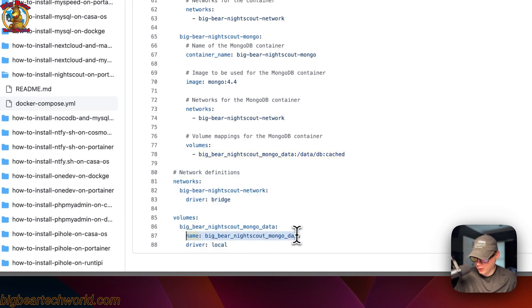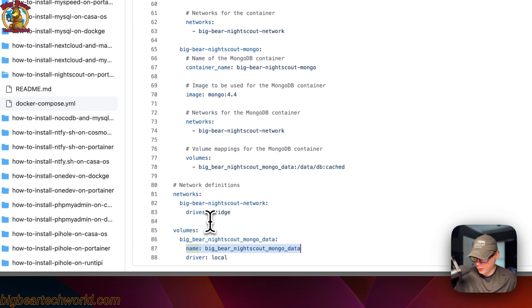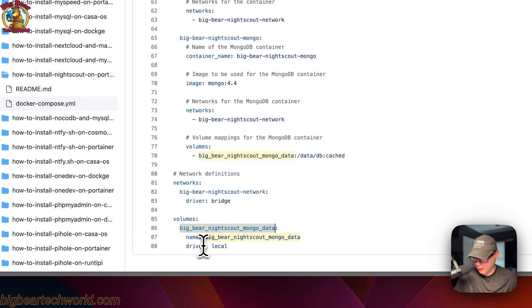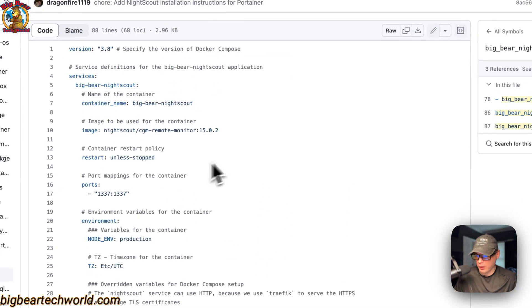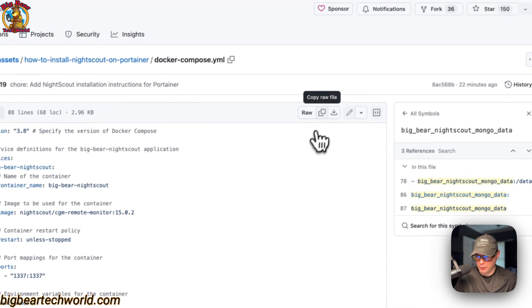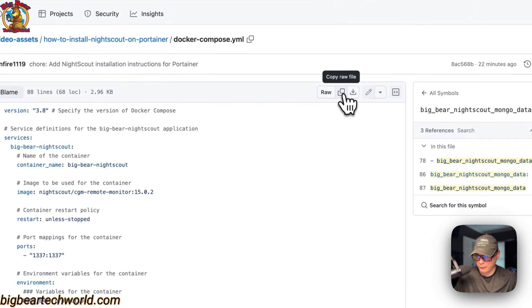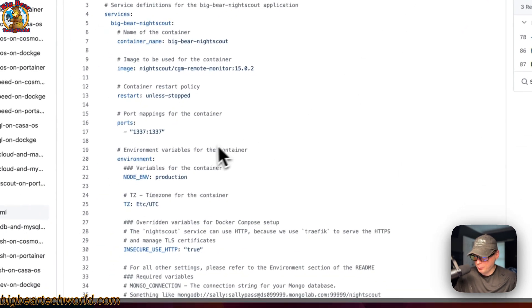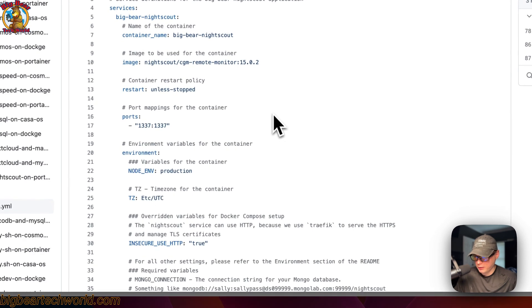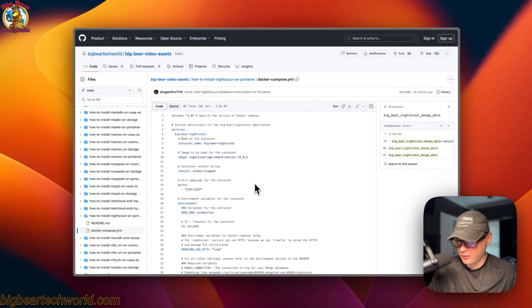The volume is named explicitly so Docker doesn't generate a random prefix — it will use this exact volume name with a local driver. I'll now click 'Copy Raw File' and then go over to Portainer to get this set up and installed.